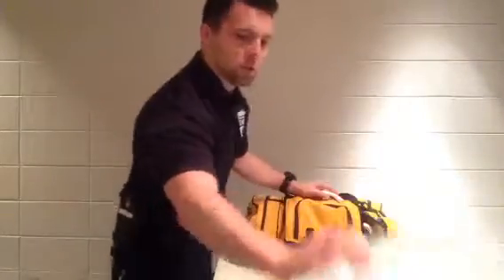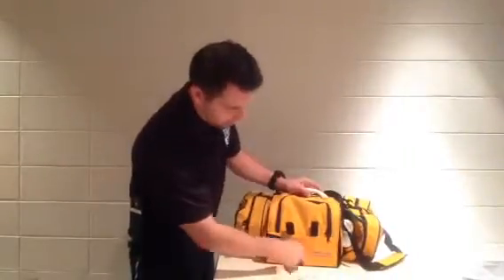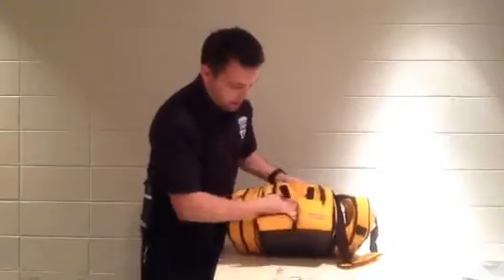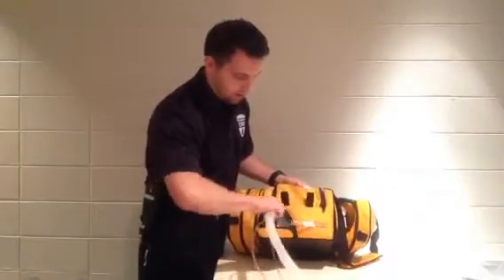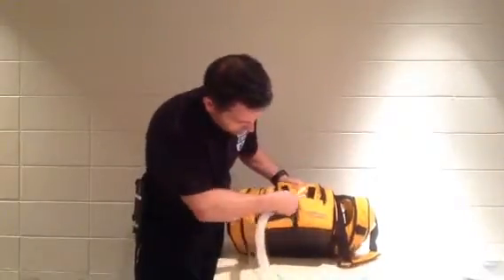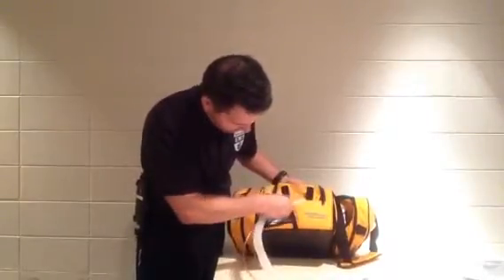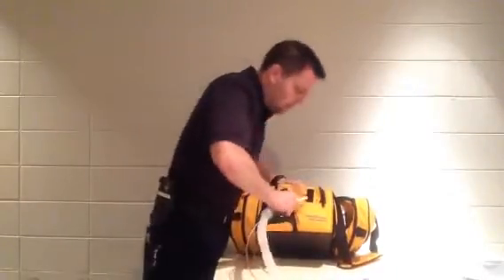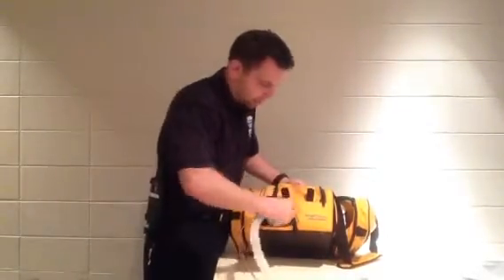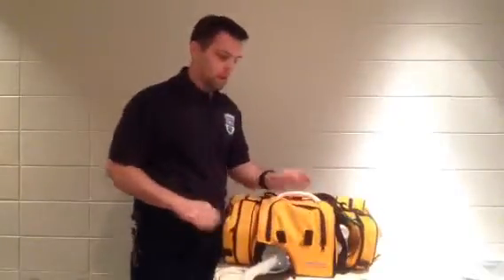When we come to the ventilator the hookup is pretty simple — we can just unzip this section right here and expose our ports, and we just have the three. So we seat that on real nice — that's our output. We've got our prox line which is blue and it actually says prox line next to the nipple, just squeeze that on. And then we've got our exhalation valve which is white, and that's our trimmed down one. And there we go, we're hooked up.